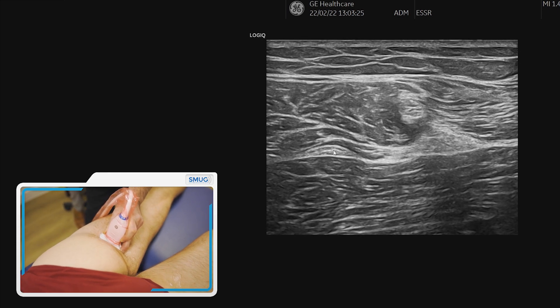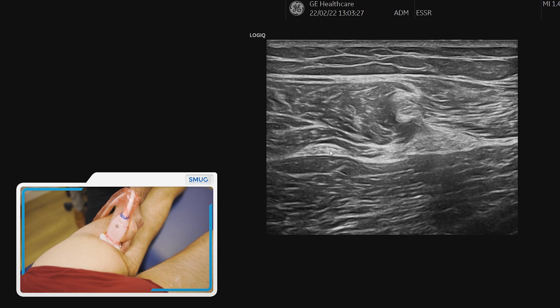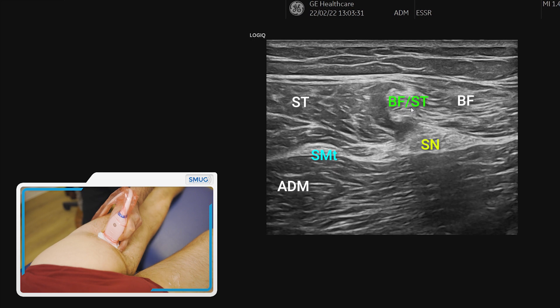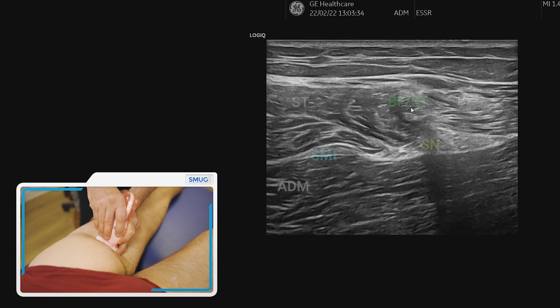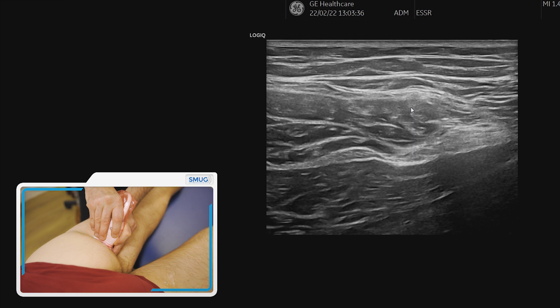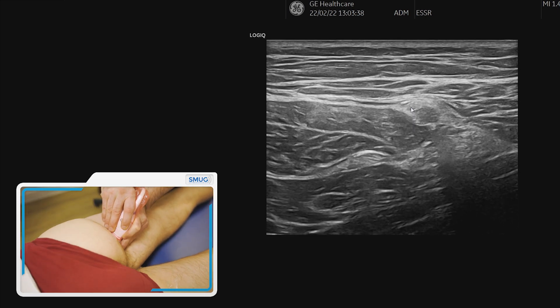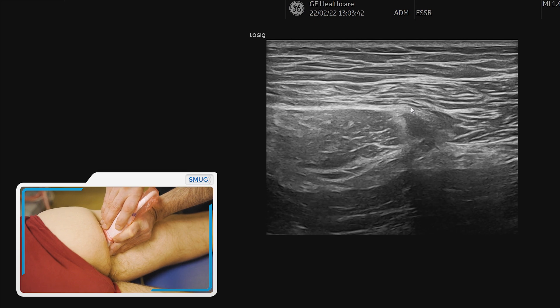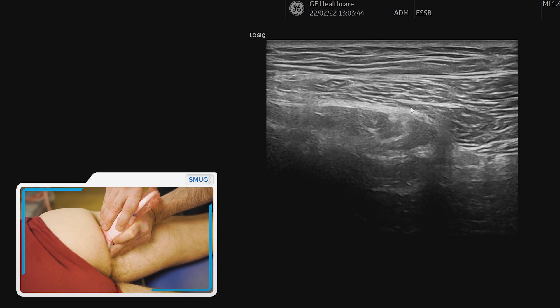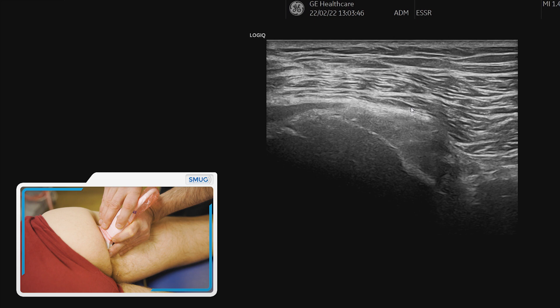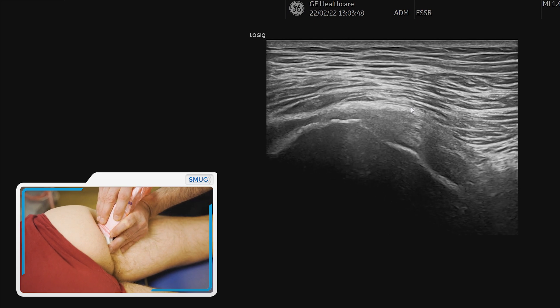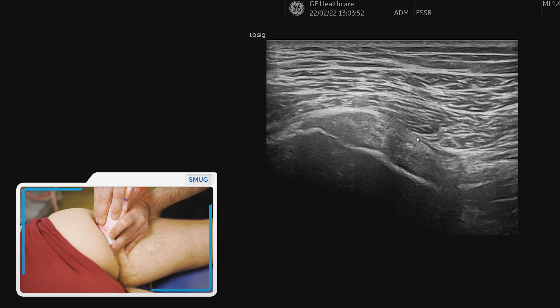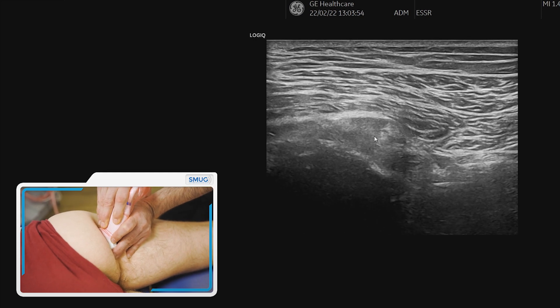Going back to the center point of these structures — on the left medial side the semimembranosus tendon, the sciatic nerve laterally, and on top the conjoined tendon — if we follow these three structures proximally we can trace them to the attachment. Following them up to the footprint at the attachment, angling a bit more lateral you can see the two bundles individually, then going back distally we return to our starting point.